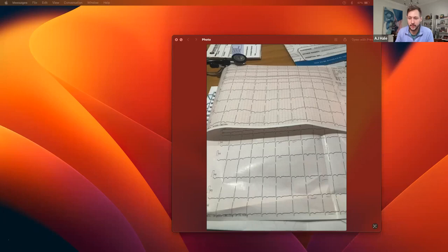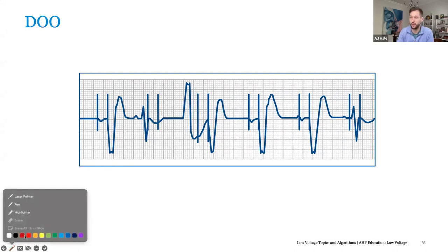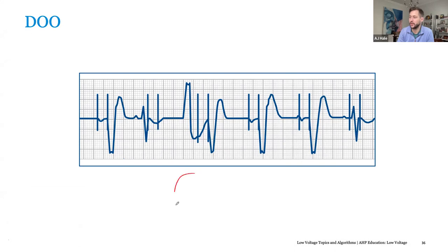The reason being, you can eventually contribute to their heart failure symptoms, and then we do end up having to put a CRT in them. So in this case, they have intermittent issues. They have their SA node, AV node, His bundle, and then conduction system to the ventricles. And this all seems to be functioning fine right now.